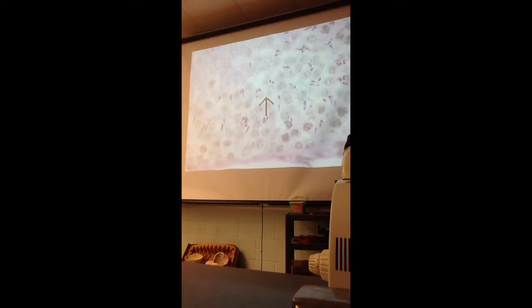Can you see these cells with relatively larger nuclei? Spermatocytes. We don't know if they are primary or secondary, but probably primary when they are closer towards the bottom. Secondary spermatocytes probably, and when they go towards the lumen, you can see the spermatids. Right? And in the lumen, you can see the sperms.